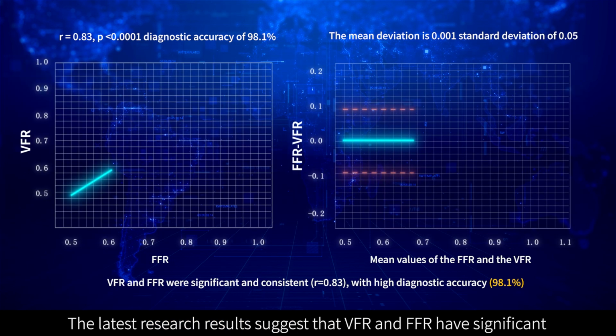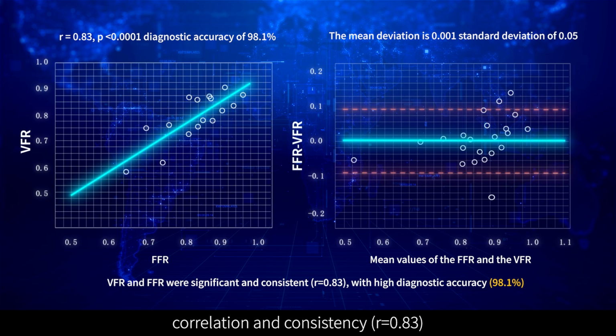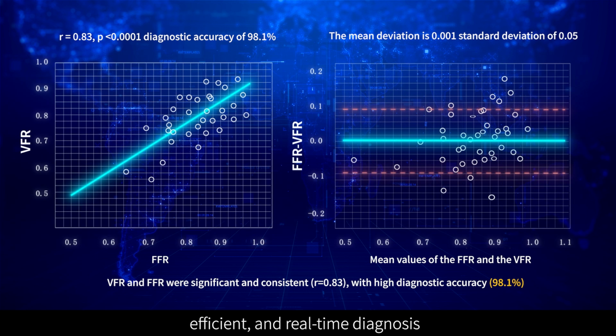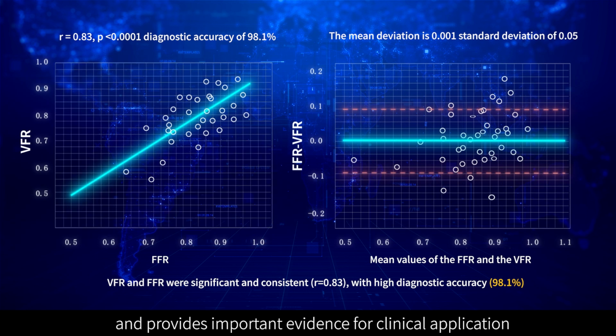The latest research results suggest that VFR and FFR have significant correlation and consistency, and the diagnostic accuracy reaches 98.1%. The VFR algorithm has the characteristics of automatic, efficient, and real-time diagnosis. This study confirms the accuracy of the VFR algorithm and provides important evidence for clinical application.